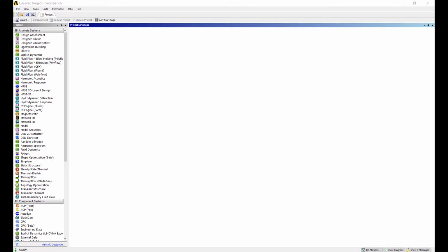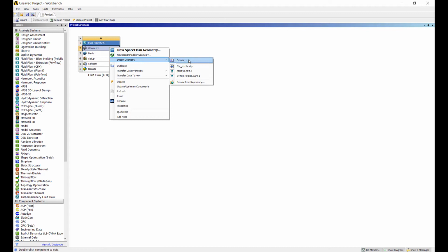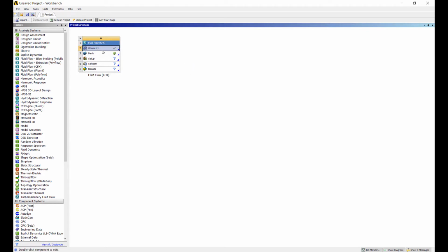In this video, we'll be using ANSYS CFD because we're going to actually be calculating the hemolysis values. ANSYS CFD is a very powerful set of tools that lets you solve virtually any problem in computational fluid dynamics. So here I'm loading up the model, and let's make a few small changes to it to prepare for further analysis.